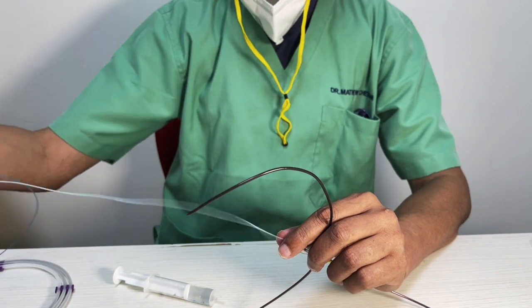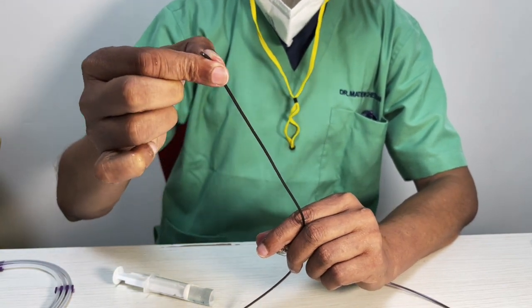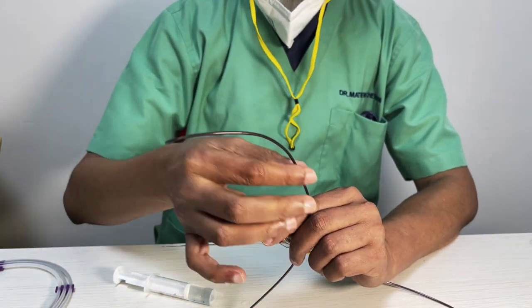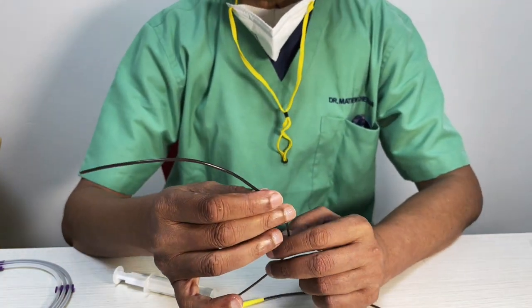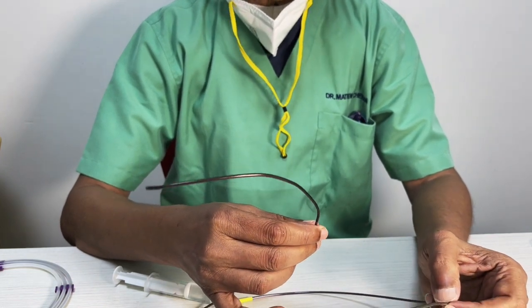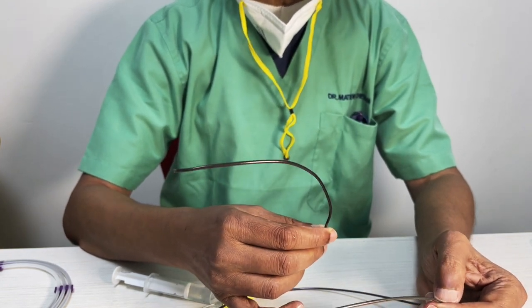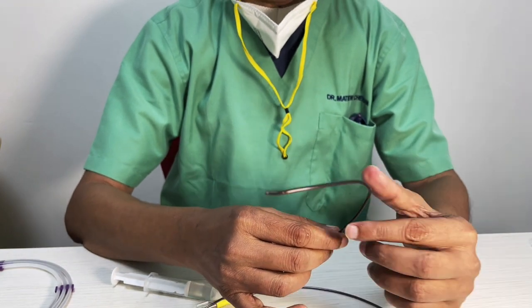So I wanted to get this across. It is purely the property of what is the braiding. Same spiral braiding, same distal lubricious coating, same zones they have used. They say 5 zones, 12 zones. Actually, it doesn't make a big difference to us because each company says they got different zones. And of course, we have got the Cat 5 and Cat 6, which they call zoneless, just by continuously changing the density of the spiral. But I want you to get this. I hope you got this clear.